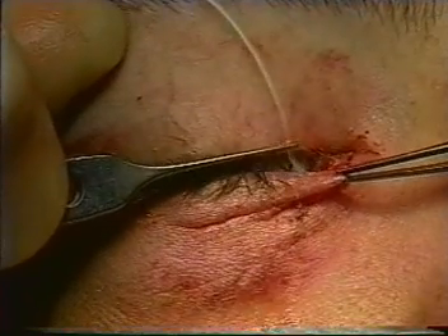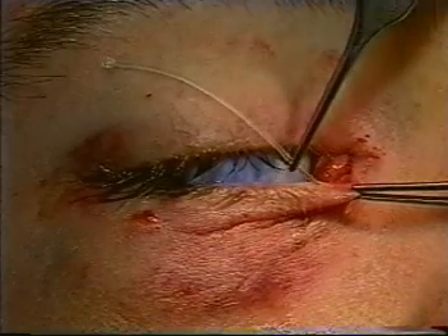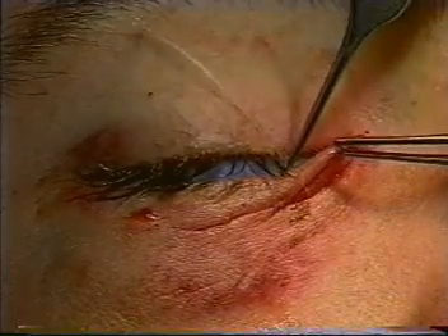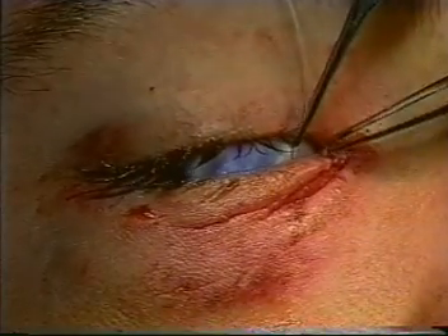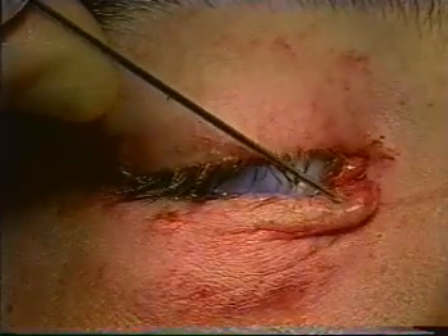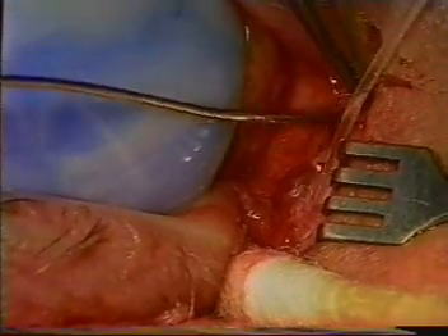We gently insert the cut end into the punctum, push it into the canaliculus, and retrieve it through the cut end. Using the inserter, it is necessary to press the small ledge on the end of the plug to anchor the tube in the punctum. We can see the plug sitting flush with the canaliculus and the punctum in this area.